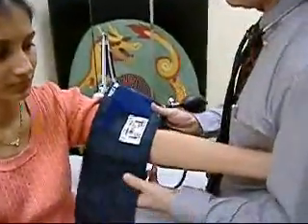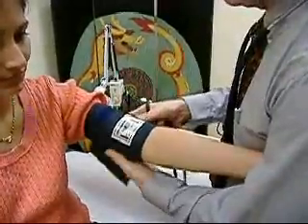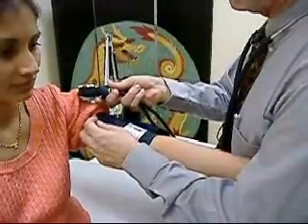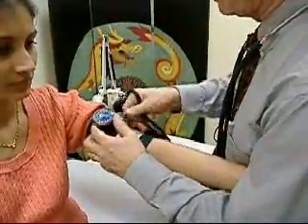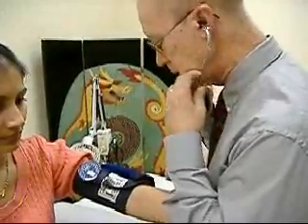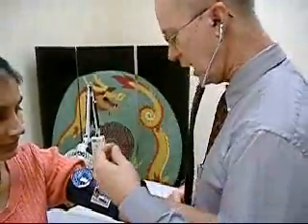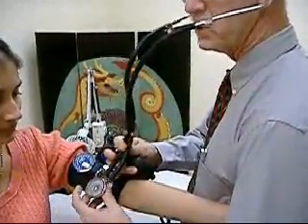I'll lay the cuff on her arm, give a slight tug, a push, and the velcro will engage. The manometer can either go on the clothing or on the little strap depending upon how secure you need it to be. Stethoscope — the earpieces angle forward, because your ear canal does. Always check to make sure that you have the head turned the right way. Stroke it, don't tap it. Go ahead if you want to tap it, you'll see.